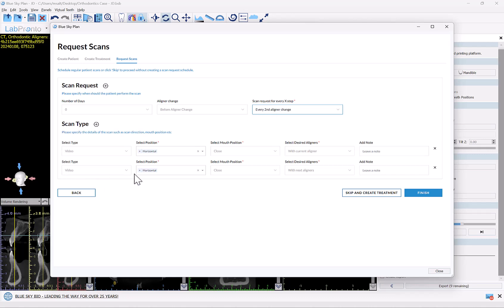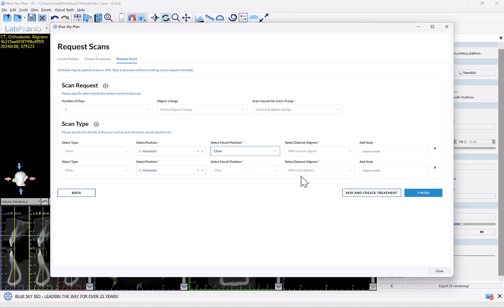Next, we set what type of scan the patient will be prompted to perform. In their app on their cell phone, it will tell them exactly what to do — exactly when to put the scope in their mouth, how to move the scope, and they'll be prompted step by step. For each scan session they will be doing two video scans: a horizontal video scan with mouth closed with their current aligner, then a second horizontal video scan with mouth closed but with their next aligner. Once they finish the scans, they press submit and it transfers automatically to the Blue Sky Monitoring clinical dashboard.